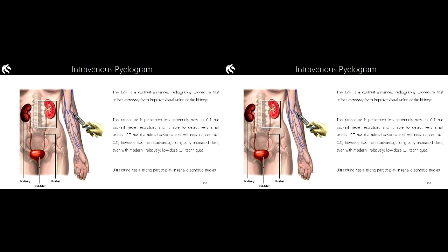That equipment is, to the best of my knowledge, no longer made, and the equipment which is still currently in practice either is going to be very, very difficult to repair and/or will be so old that it is too old to make Medicare billing a possibility, okay? Because Medicare billing requires that your X-ray machine is under a certain age.